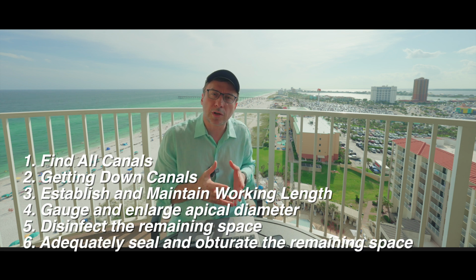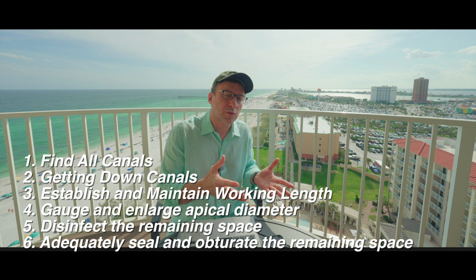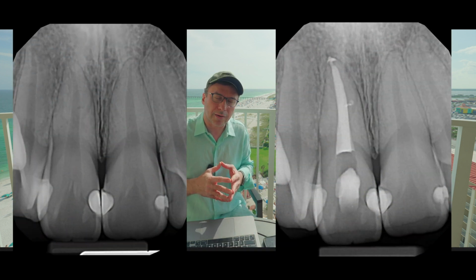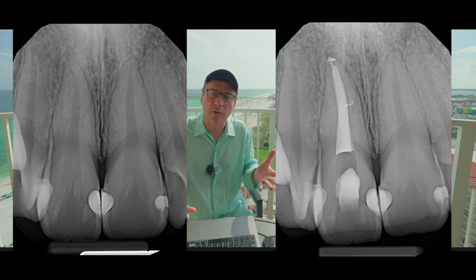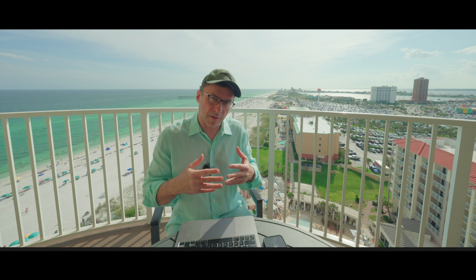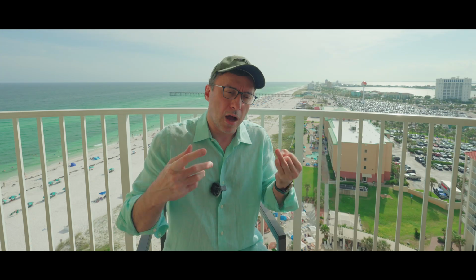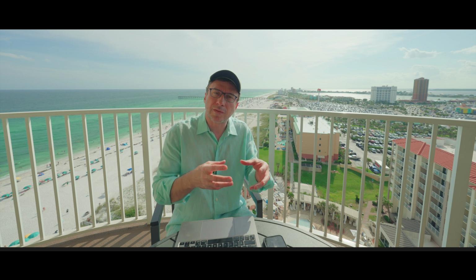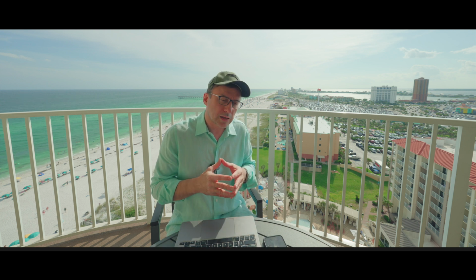Now, the look that you achieve from what we see on the x-ray is primarily a function of the radiopacifiers and the filling material. But as I mentioned, the important part is the parts that precede that. And so we need to keep on focusing on that again. How can we find all the canals? CBCT and a good understanding of the normal anatomical distribution of the number of canals and their locations in a given population and a given tooth is very important.